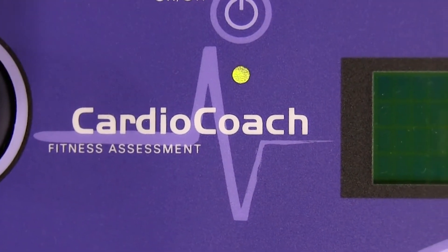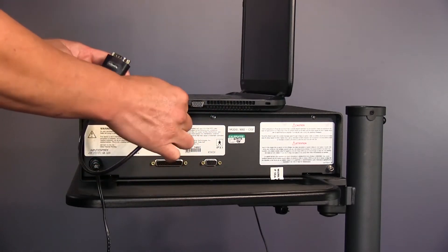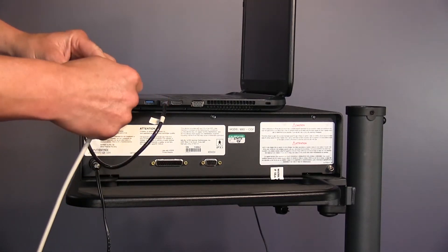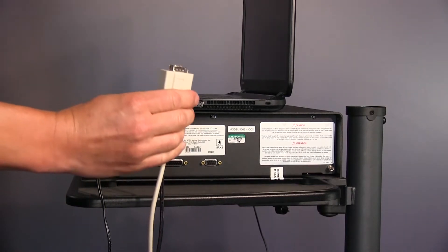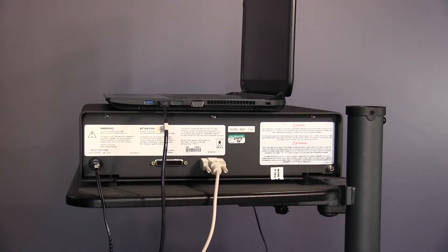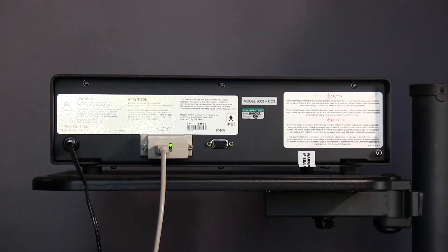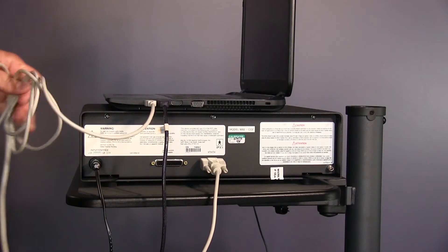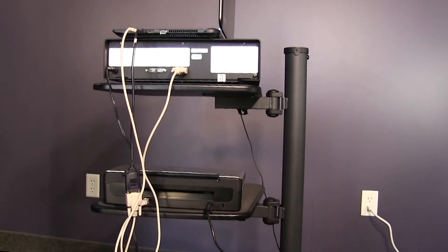A green light will illuminate under the on-off button. Next, plug the USB converter into an open USB port on your computer, then plug the converter into the 9-pin serial cable. Plug the other end of the serial cable into the 9-pin serial adapter on the back of the CardioCoach. Note that your CardioCoach purchase included an HP printer — do not connect the printer directly to the CardioCoach. Instead, connect the printer to your laptop using an open USB port and the included USB cable, and follow the enclosed HP printer instructions for installation.